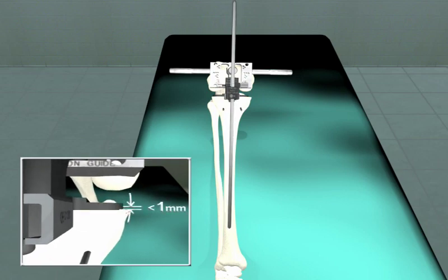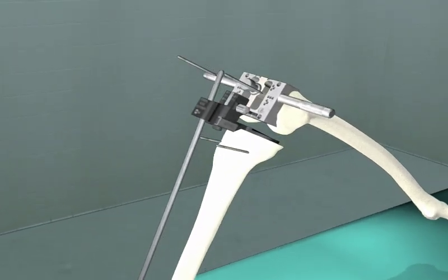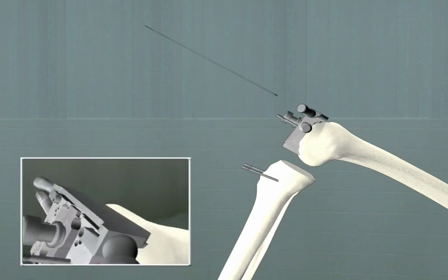The alignment rod can be used to assess the amount of tension in either compartment. This alignment rod also can be brought down to the tibia to check for proper tibial resection angle. The guide is then pinned into place, giving equal compartment tension medially and laterally. The anterior femur is then resected with a power saw through the capture plate.